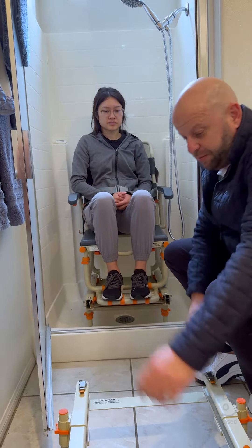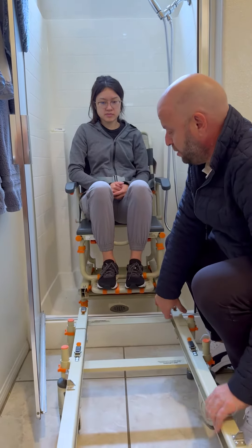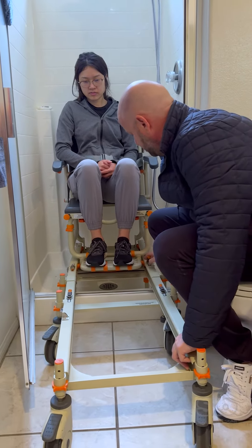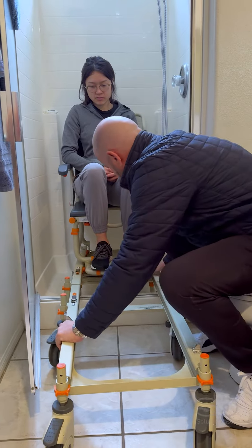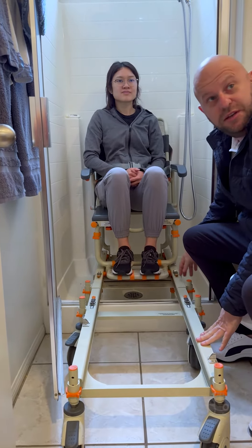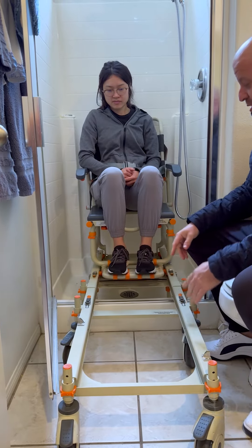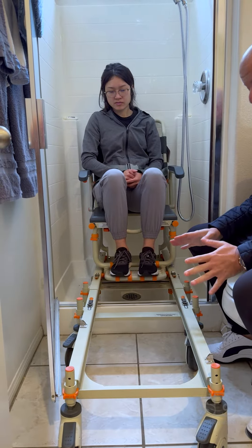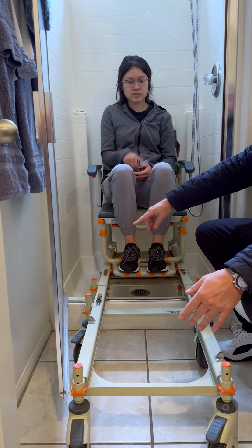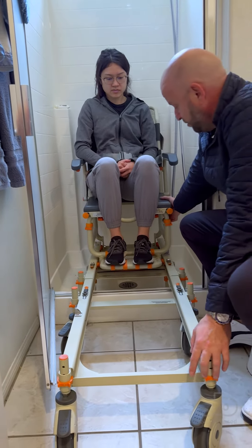Once you're done bathing, you're going to attach to the bridge. It's two latches. This seems to be a pretty comfortable area because if you're standing in front and you need it to latch in the back, it might be a little difficult.